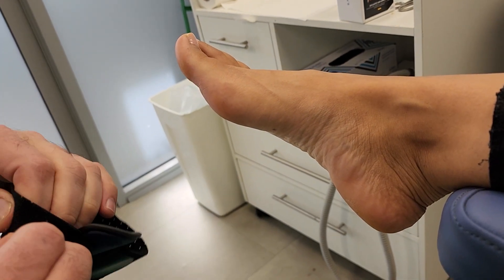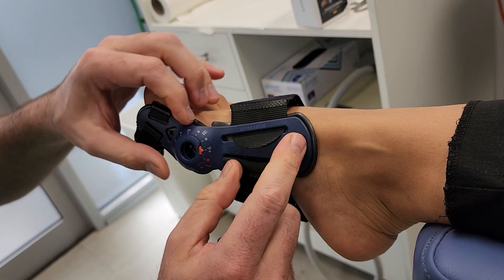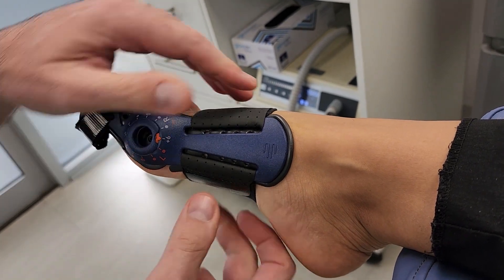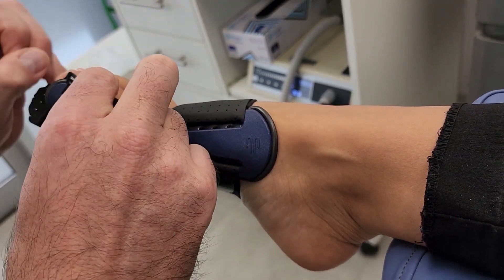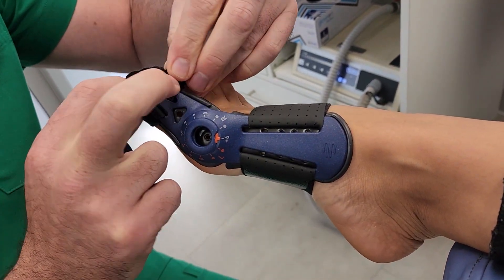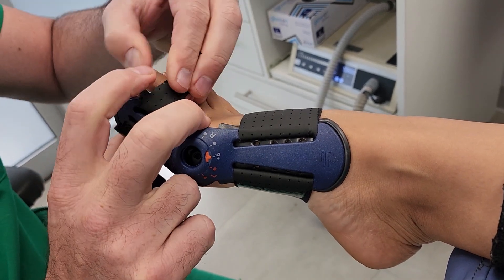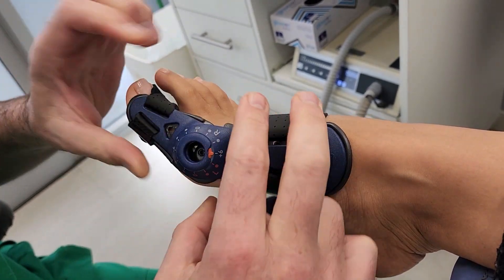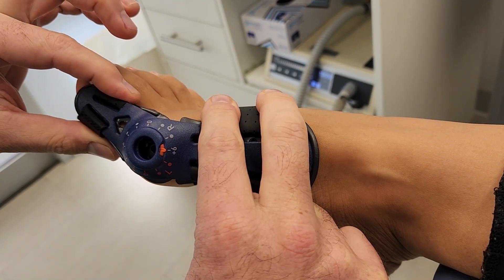Now I'm going to fit this onto Amanda so she can feel what it's like. You can weight bear with this. I've asked patients who have been wearing it if there's been any discomfort around the straps of the midfoot or the hallux, and they haven't had any discomfort at all. I'll fit that over the toe. Then once I've fitted this on, I'll get Amanda to walk around and tell me how much immobilization she's actually getting from the splint. That's how it fits, and once again it should keep that joint pretty rigid.